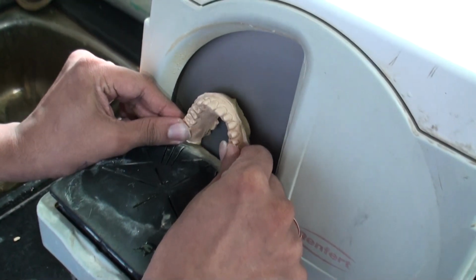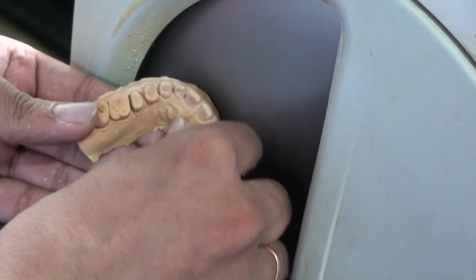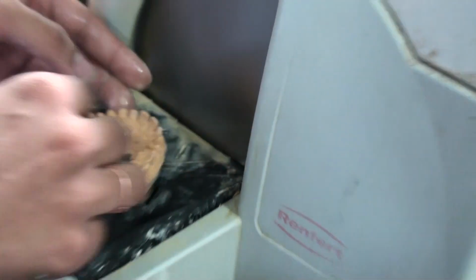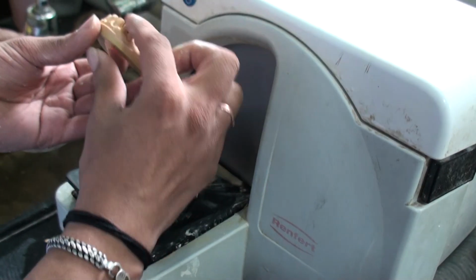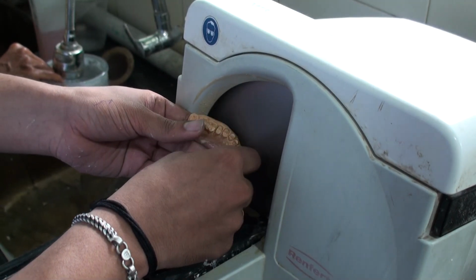So we use a model trimmer here, and this one has a rotating disc with water constantly flushing it. So he's basically trying to remove all the rough edges from the sides. He takes it off in several increments. And he also trims the base because he wants to try and make the base of even thickness. So there he's trying to show that the base is even on both sides. Gives it some final finishing touches.